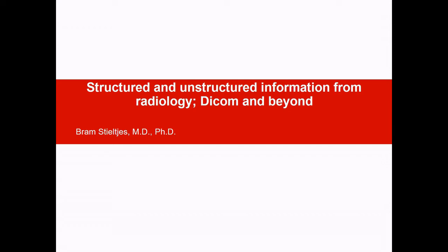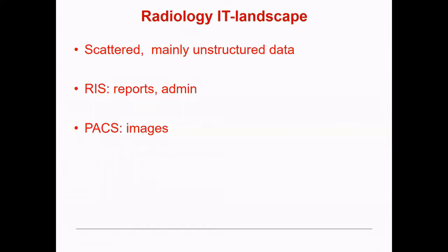I thought I might want to expand today a little bit beyond DICOM and also share with you what other interesting information is where in radiology and how we can maybe get it out for, for instance, research purposes. So maybe as a first step, it's good to talk about the very big elements in a radiology IT landscape.